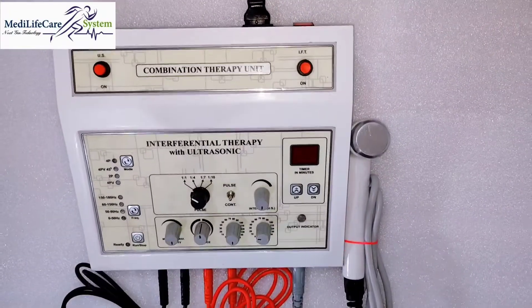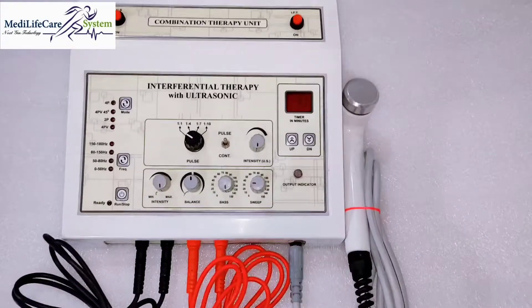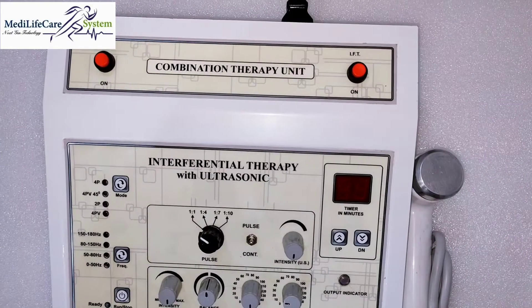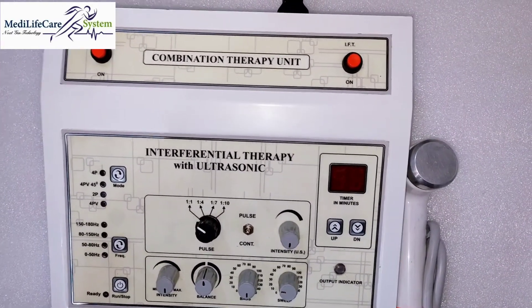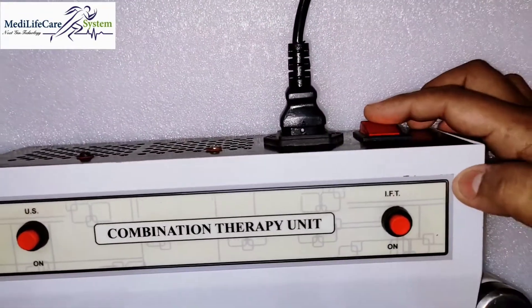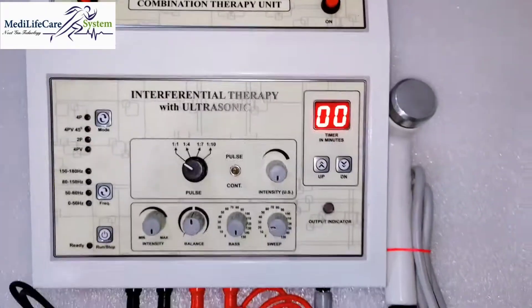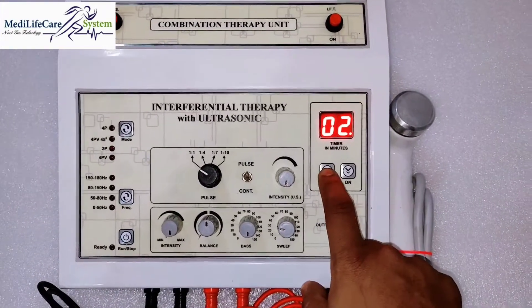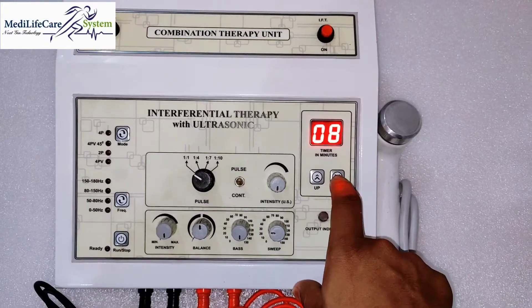So without wasting any time, let's get started. This is the machine. As you can see, there are two buttons for separate programs — one is for IFT and one is for ultrasonic. For starting, there is a heavy-quality on/off button. After pressing the on button, the buzzer will beep, then you have to set the time as per your requirement from here.